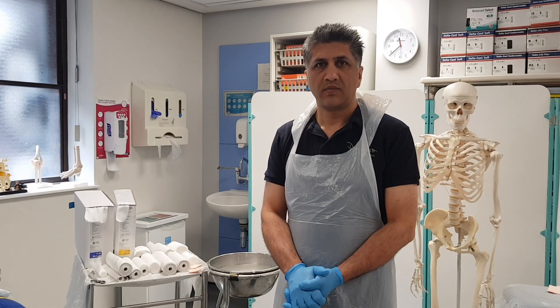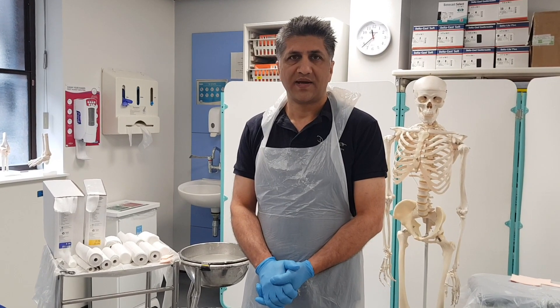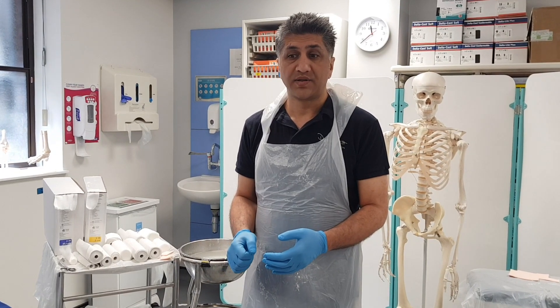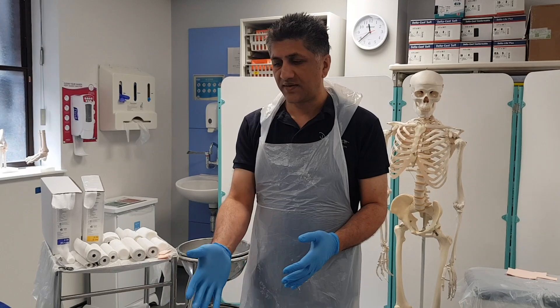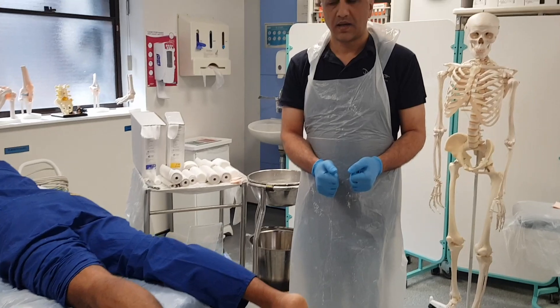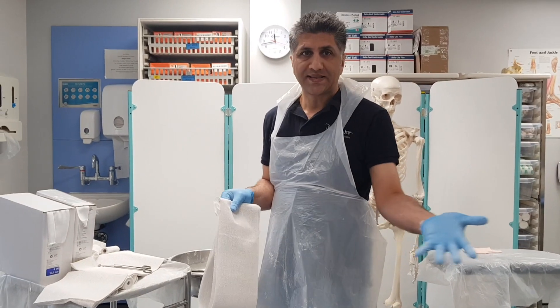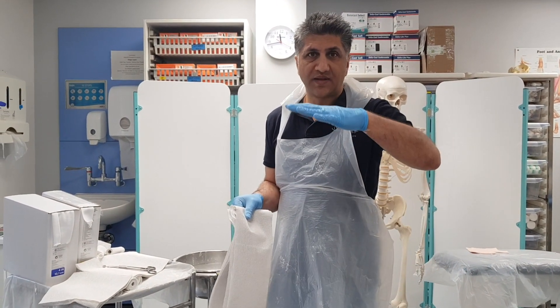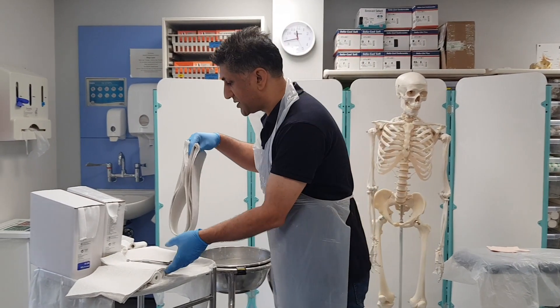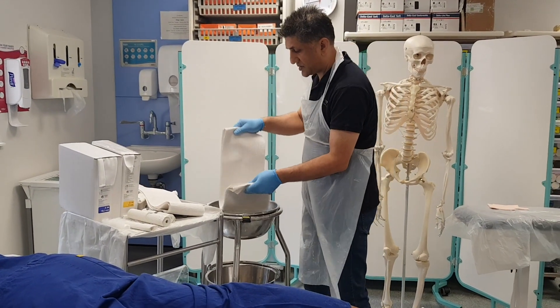This time we're going to apply a below-knee back slab, but if you don't have much help and your patient has been sedated, it's far easier to apply the back slab with the patient prone. Armour is now lying face down — I'm going to assume he's got a broken ankle and we're going to apply our plaster back slab. Previously when the patient was supine, putting the back slab on first meant it was likely to fall off with gravity; now gravity is our friend and that's going to help us.